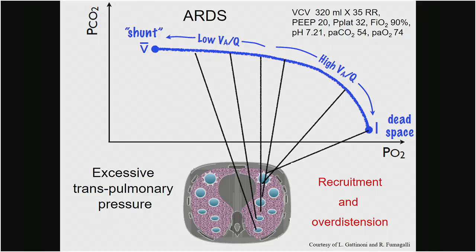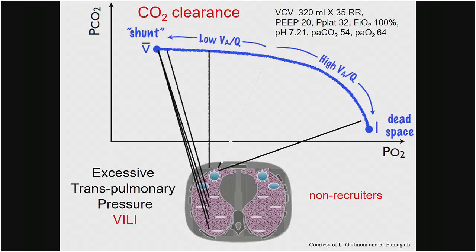And so we are generating areas of dead space, and these will likely increase the CO2. In fact, the CO2 in this case was increased from 38 to 54, okay? Because that will create two issues. One, create some areas of dead space, and potentially we would redistribute the perfusion of the lung toward the lower zones where the VQ matching is not as advantageous. Next, please.